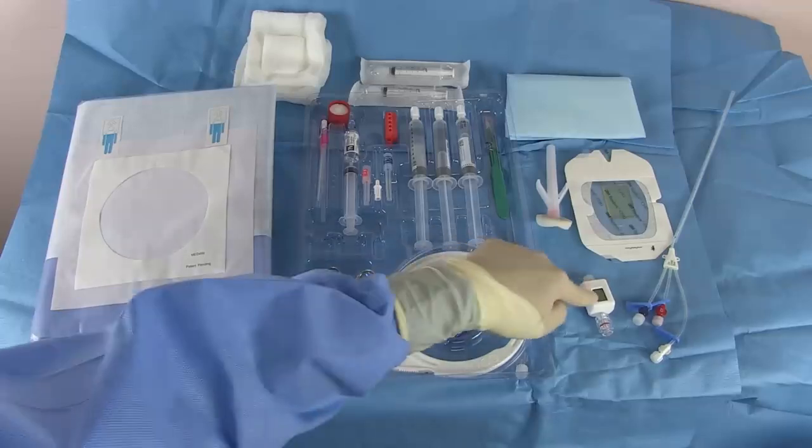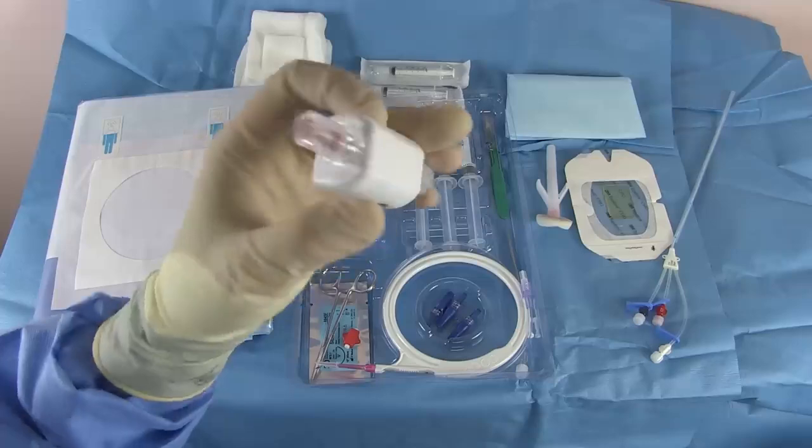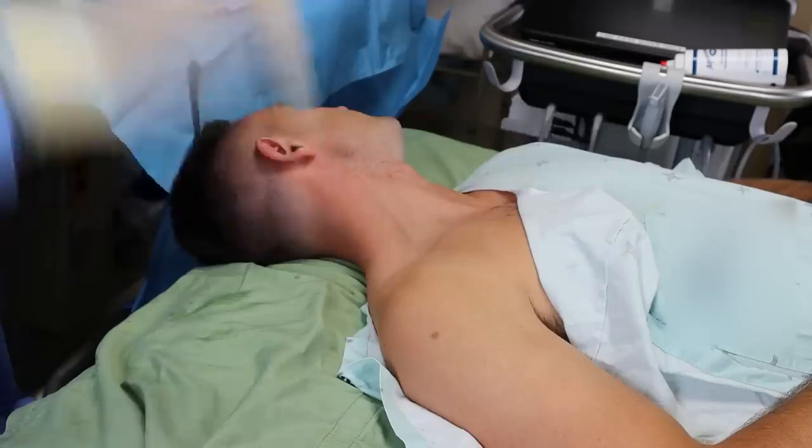And I want to show you the compass pressure transducer. It measures the pressure in the vessel you cannulate. Some hospitals have them, some don't. I won't do the procedure with it, but wanted to show you in case you have them available. Alright, let's start the procedure.